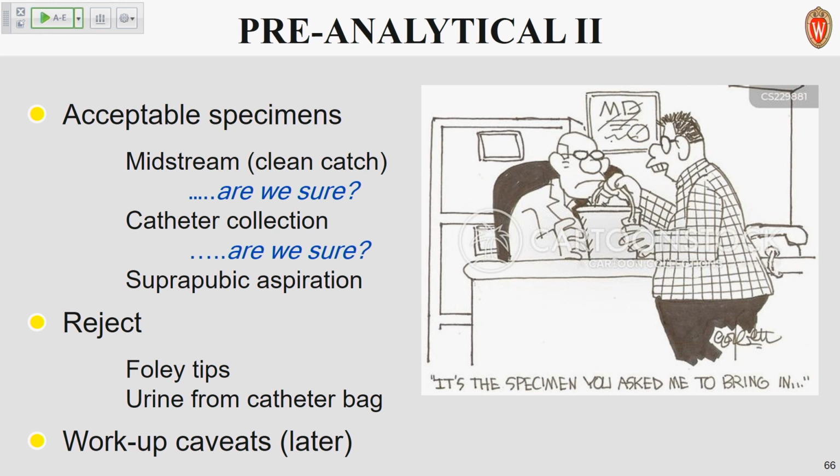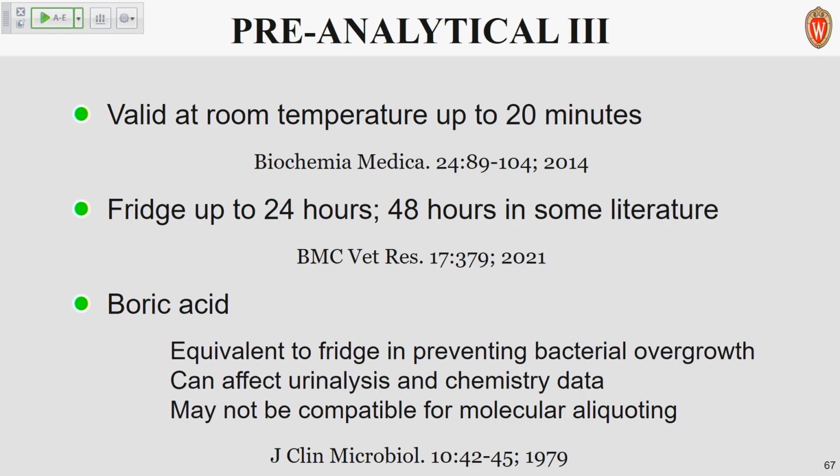Suprapubic aspirations are acceptable. We should not be culturing Foley tips or urine that was sitting in a catheter bag, fermenting. And then there will be some workup caveats we will talk about a little later.